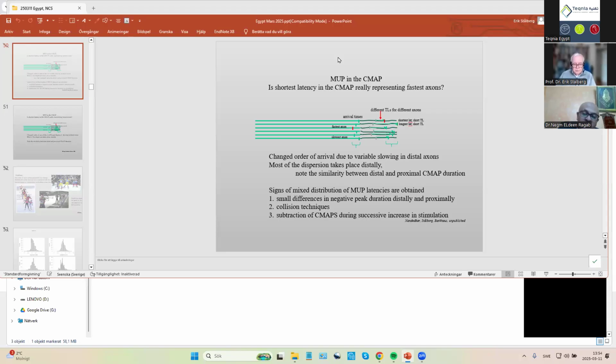What do you think? Very good questions. He has very nice pictures of that. We think it is time consuming. We think it's a very nice detailed study, and it taught us that the main compression is at the distal end of the transcarpal ligament. That is what we learned.